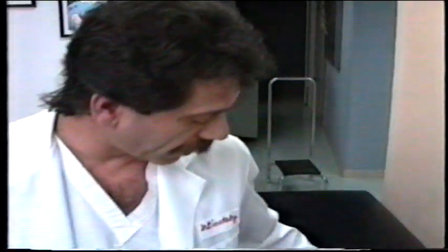At this point, I would like the patient to perform 50 exercises in my presence. And let's take a look at her face, how painful she is, or in how much pain she is. Janice, you can pick up your head. Are you dizzy now? Yes. And this is a good sign that you have addressed a proper area, because the facet joints do contain the positional receptors.